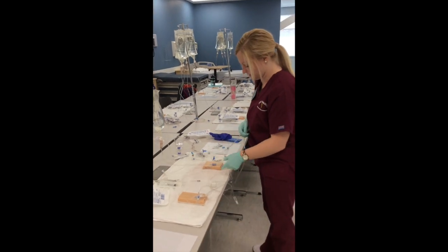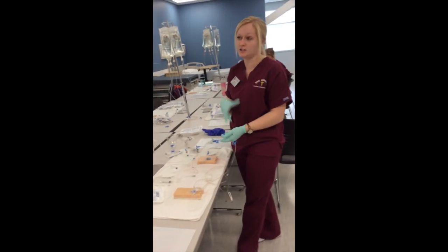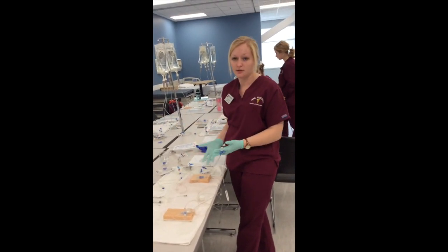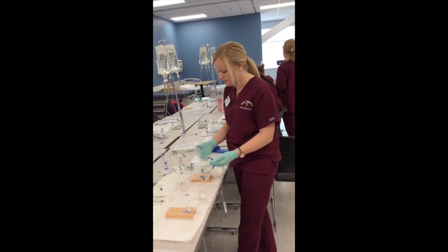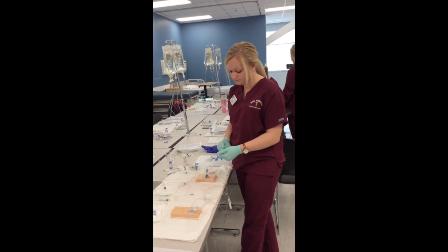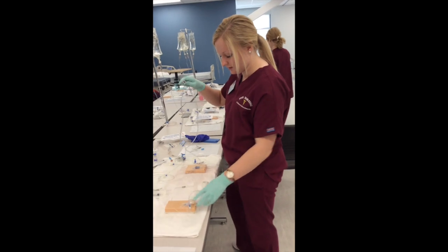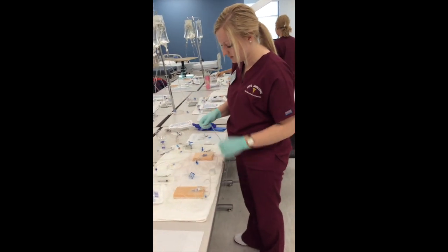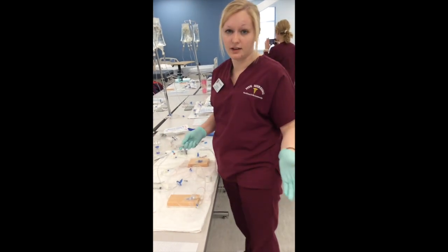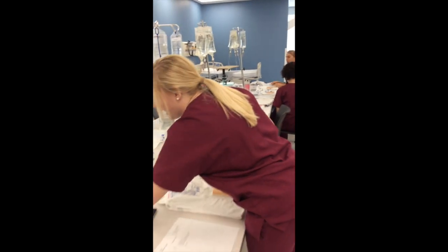And of course, one of the biggest things before I go ahead and push this through, since the normal saline's already going through, my IV should be patent. But I'm going to look for infiltration, look for any coolness or any problems like that. So since I am sure that everything is good, I'm going to go ahead and start calculating my drip rate. And since I've already performed my calculations, that's something that I did whenever I got the medication out.